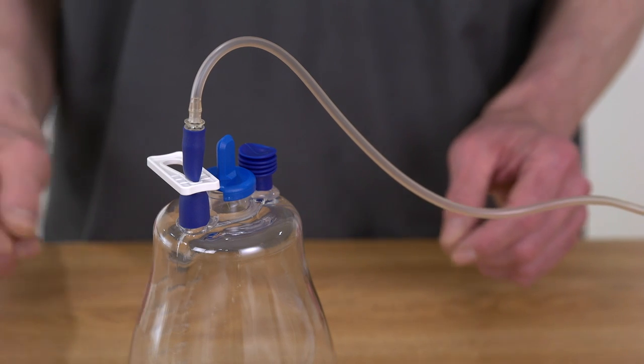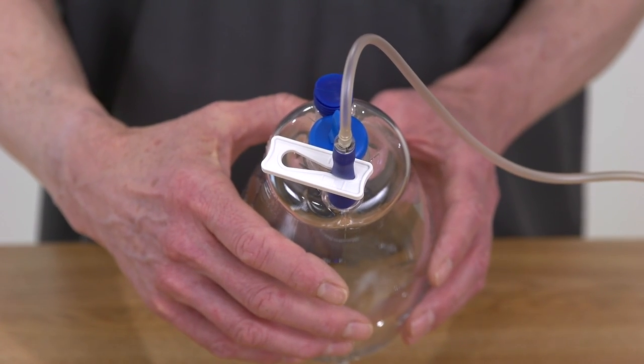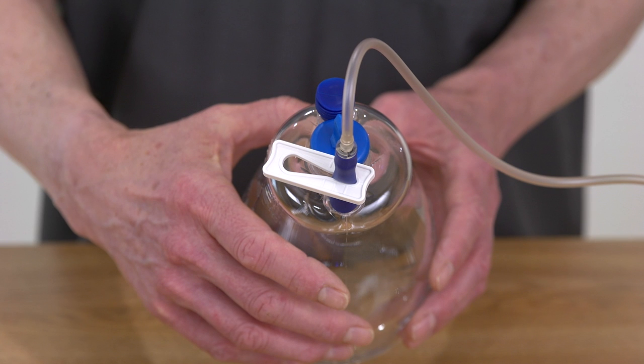Take a moment to examine the drainage bottle. The bottle comes pre-evacuated. The white slide clamp on the top of the bottle should be in the closed position, pinching the tubing to prevent any loss of vacuum from the bottle.